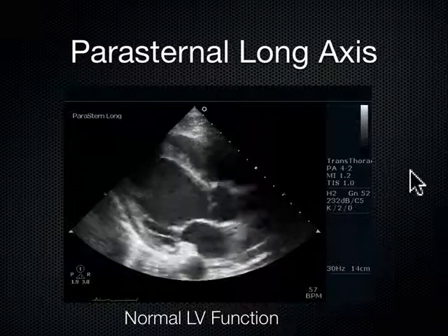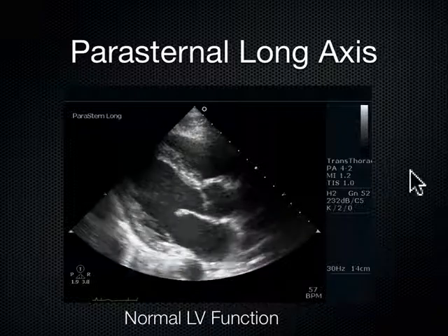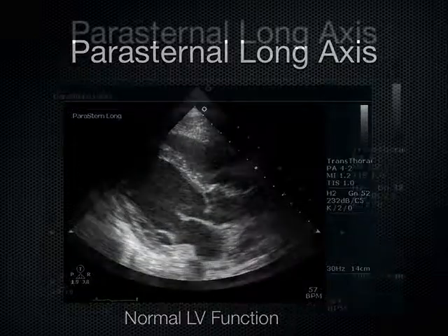And that's what I want you guys to remember. Quantitatively, I think the cardiac output stuff we're about to do is very useful. Ejection fractions, I don't know. I just like to look at these hearts and decide what I'm going to do next.